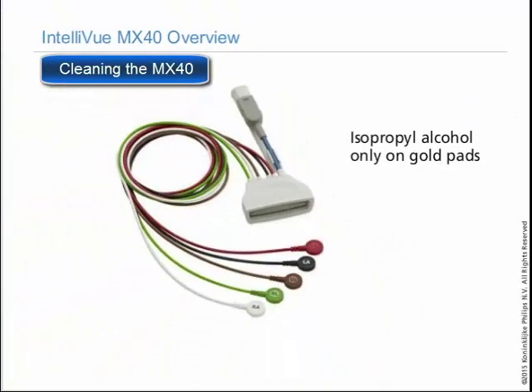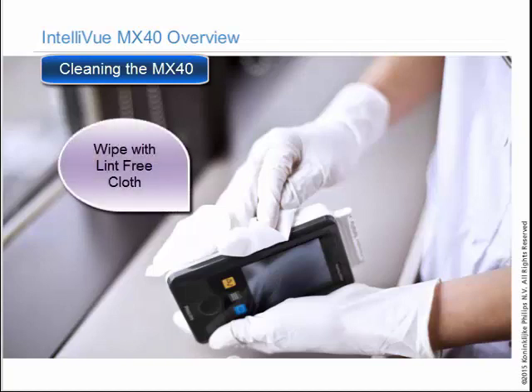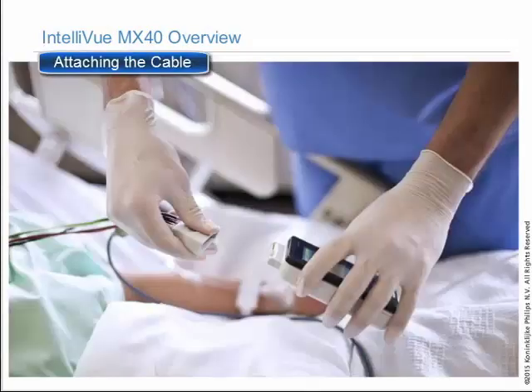If you must clean inside the patient cable connector, use only isopropyl alcohol on the gold pads, followed by a lint-free cloth, dampened with water. Remove cleaner residue by wiping the MX40, patient cables, and battery tray with a lint-free cloth, modestly dampened with distilled water, or isopropyl alcohol. Pick up your lead set and attach it to the MX40, you notice it only fits one way.